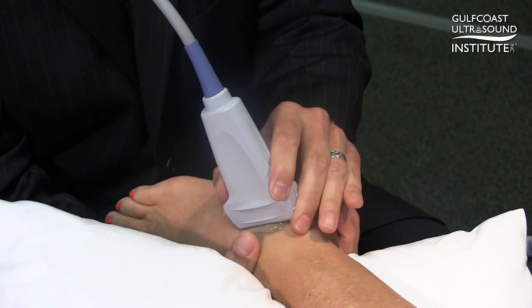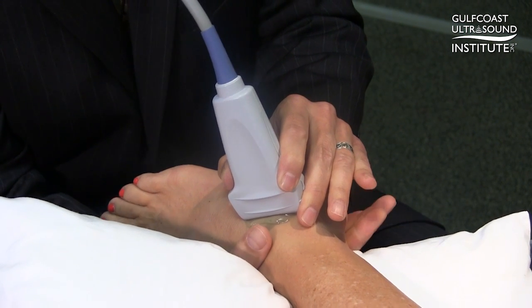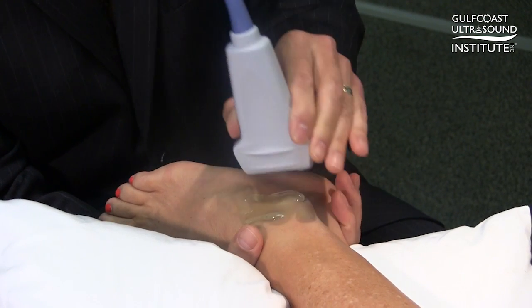With the patient properly positioned and the transducer overlying the anterior talofibular ligament, again thumb in front of the tibia, fingers around the back of the calcaneus.